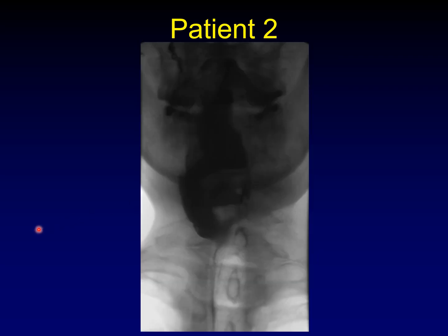Here's patient number two. You can see that there's asymmetric utilization of the piriform sinuses here as well, with a lot more of the contrast going down on the right than going down on the left.